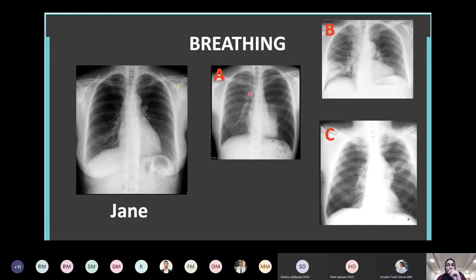Absolutely. Absolutely, Sara, this is pneumothorax of the left lung. If you look at the right lung, you can see all those vessels. There are nice shadows. You can see everything. There's a little bit of opacity or whiteness, and then there's darkness. But over here, it's just black. You can't see the vessels. You can't see the lymph nodes. You can't see anything. So this is air. I know this is very confusing, but we have air in our lungs, and sometimes that air could exit our lungs and go in between the space, so in between the parietal pleura and the visceral pleura.